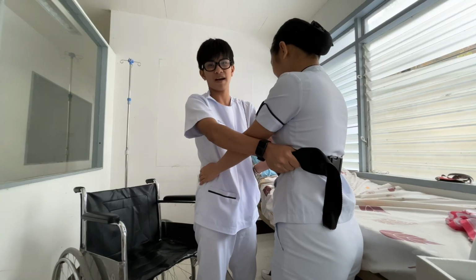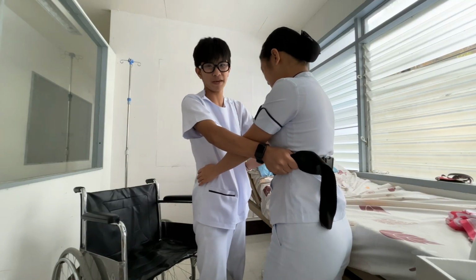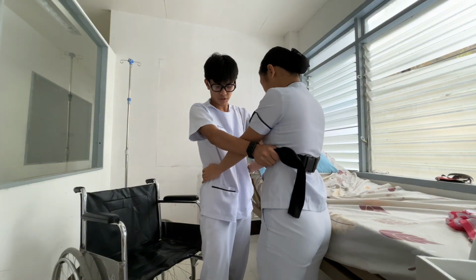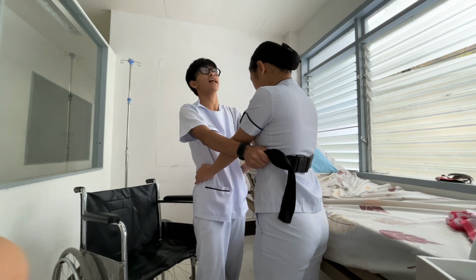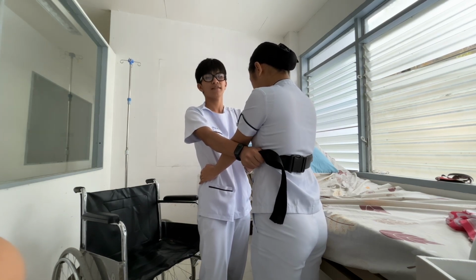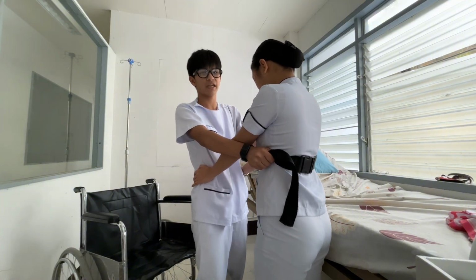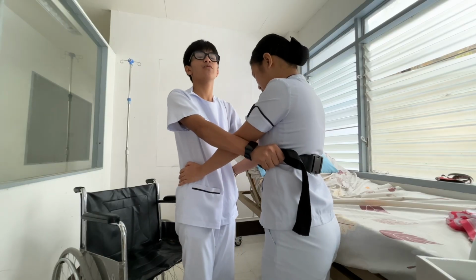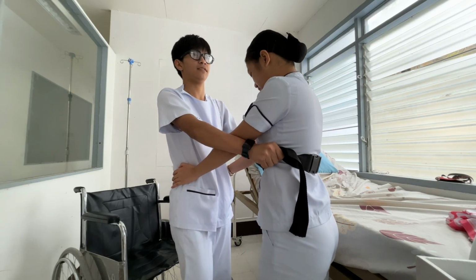So on the count of 3 and using a rocking motion, help the patient stand by shifting your weight to the back foot. So next is, once standing, have the patient take a step back until they can feel the wheelchair on the back of their legs. Have the patient grasp the arm of the wheelchair and lean forward slightly.